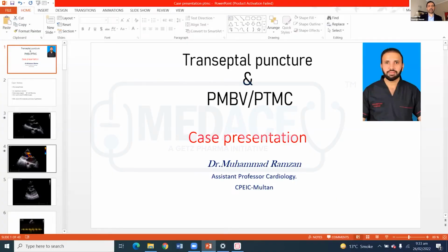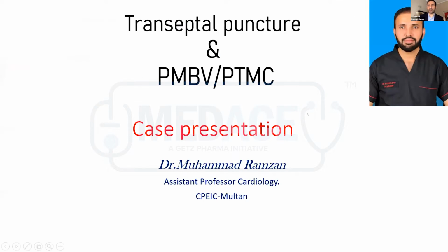While he's setting it up, Dr. Ramzan, I was interested in whether you use transesophageal echocardiography for guidance with transseptal puncture. Dr. Badar or any of the panelists, because it's very helpful. You can be very precise exactly where you're going by just having three views. If you have a short axis view looking at the aorta, you can confirm your anterior and posterior position. In your bicaval view, you can look at the superior and inferior position. In your four-chamber view, you can look at the height in relation to the mitral valve.